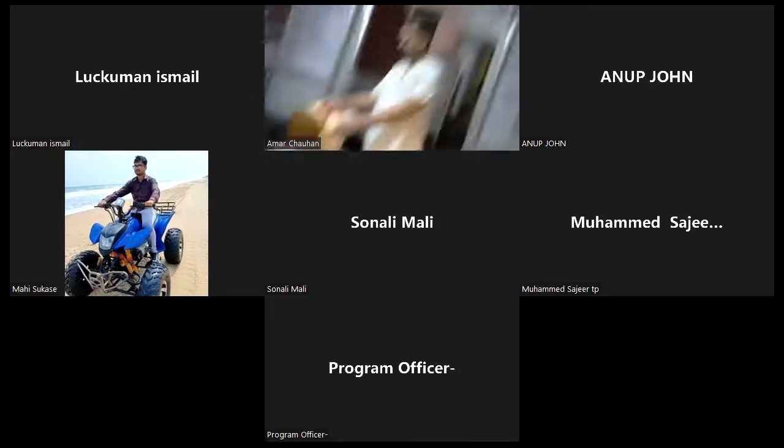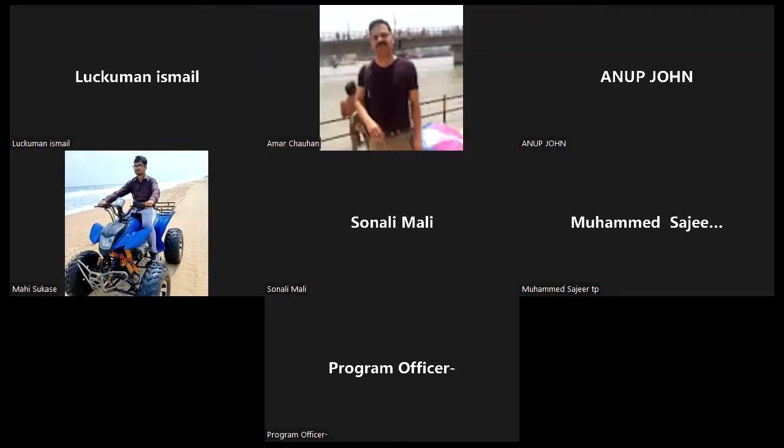So for infant and other areas, till now we have completed three products: the ICD trainer, the IO power driver, the intravenous mannequin, and the stop the bleed trainer. From adult, we need to complete the rest. Okay. So now I will demonstrate.